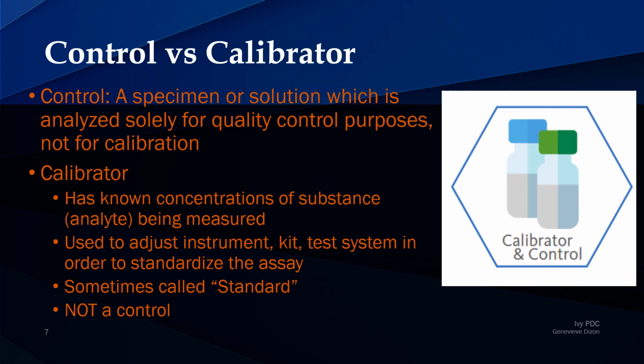Let's give another example. In our class, the calibrators would be the teachers. The teachers will teach the students, so the machines are the students. The calibrators will be the reference point. We will teach you what hematology is, what chemistry is, what clinical microscopy is. We will give you all these references. We will teach you everything. We will tell you what you should set yourself into. And now, to check if you are calibrated properly, we will give you quizzes. The quizzes would be the control running.